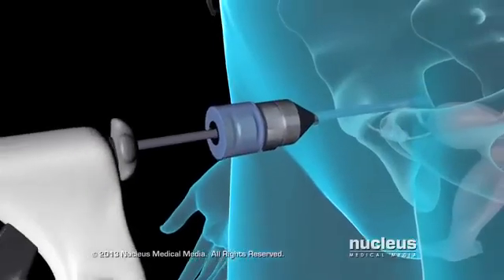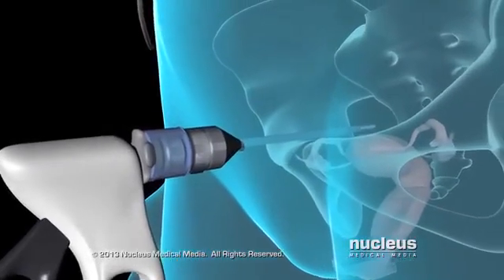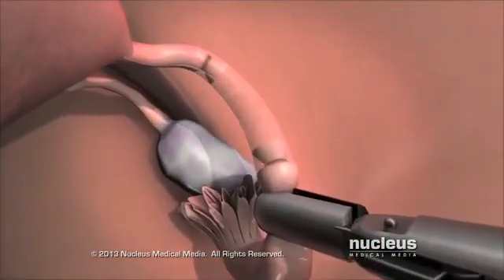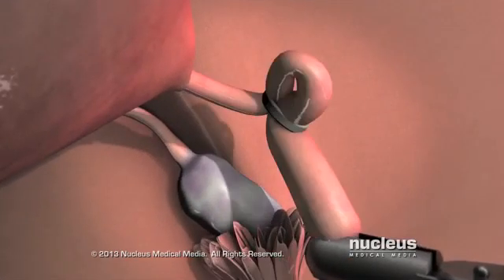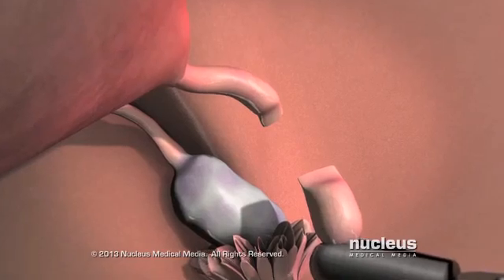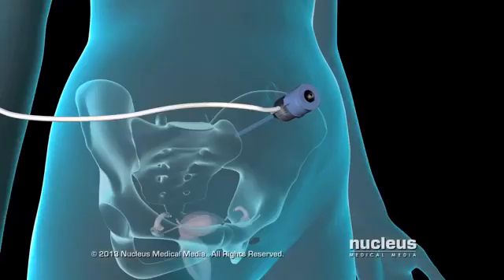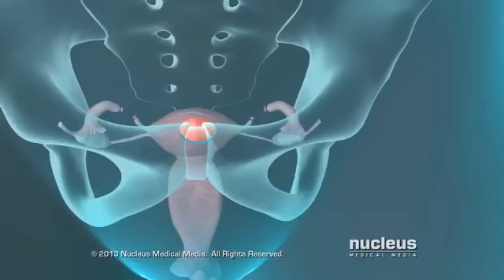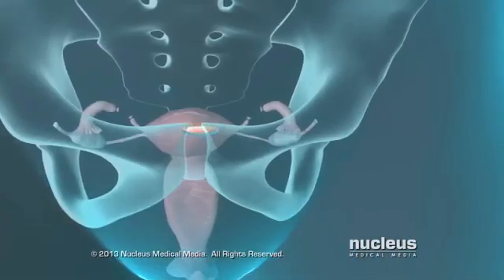Through the other incision, your doctor will pass surgical instruments to grasp your fallopian tubes and close them off using the cutting and tying, blocking, or sealing technique. At the end of the procedure, your doctor will allow the carbon dioxide to escape and close the incisions with dissolving stitches.